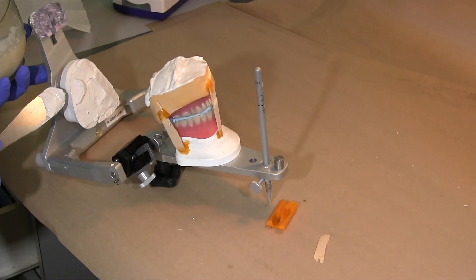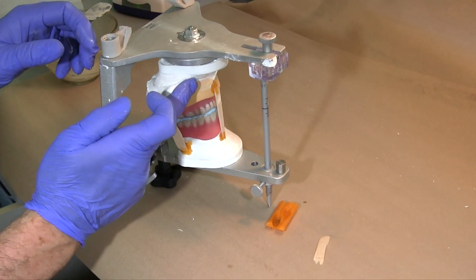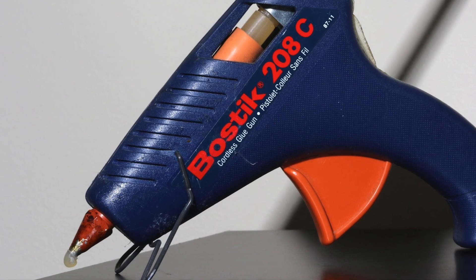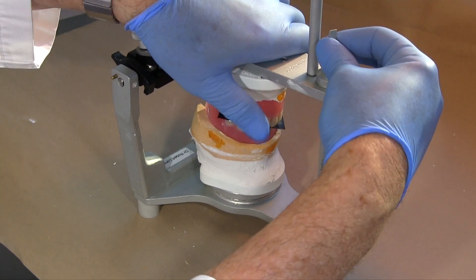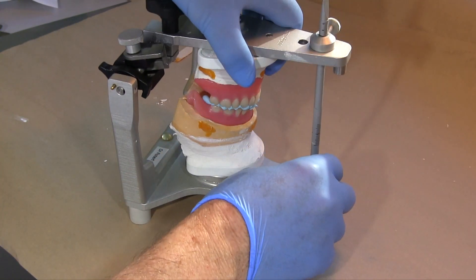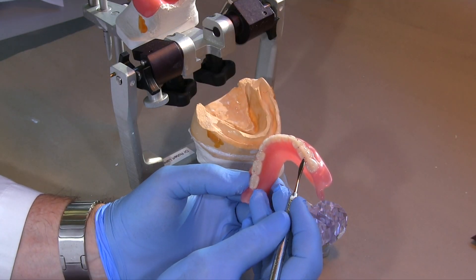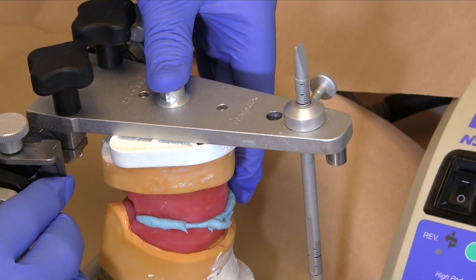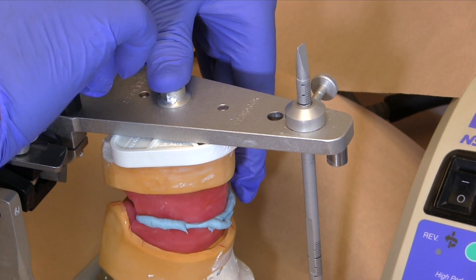This step of using rigid stabilization is critical because hand articulation has been shown to introduce large occlusal errors in the remount process. An alternative to sticky wax is to use a glue gun — it is quicker to apply but it takes some time to warm up. Remove the stabilizing sticks, adjust the incisal pin to allow the denture teeth to contact, and then check the mounting with the second record that you made previously. It is critical to recheck your mounting because any adjustments you make will be an error if your mounting is incorrect. Set the condylar guidance angles to those you have previously recorded using the wax rims on the articulator, or make a new protrusive record with the dentures.